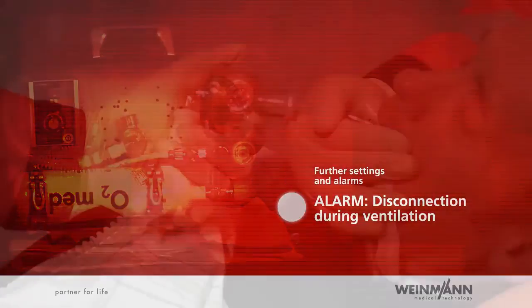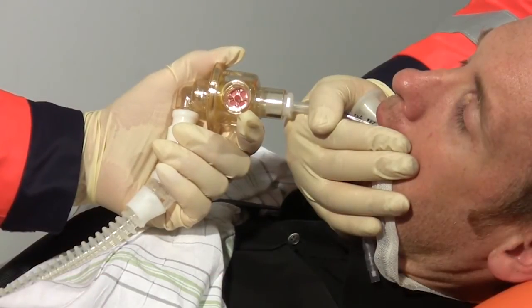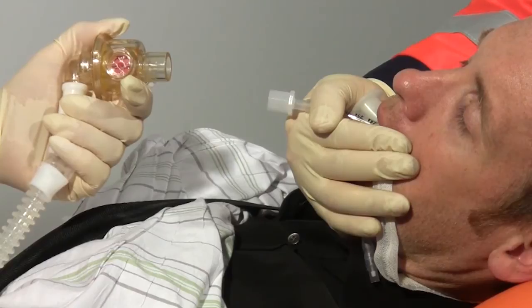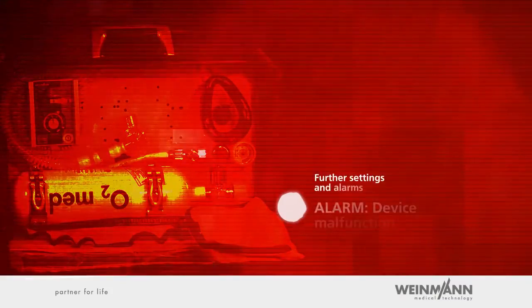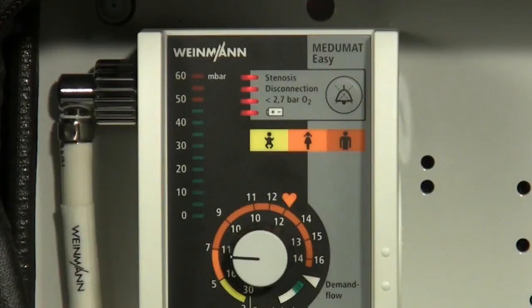Alarm — Disconnection during ventilation. Careless handling of the endotracheal tube can disconnect the patient valve from the tube. In this case, Mejumat Easy will emit the disconnection alarm after the machine's second unsuccessful attempt to apply a ventilation stroke. At the same time, the ventilation pressure gauge will show a pressure of 0 millibar. Alarm — Device malfunction: Mejumat Easy also emits an alarm at a device malfunction. If a malfunction is detected during the self-test made when the device is switched on or during regular operation, all the LEDs in the alarm field will flash constantly and an acoustic alarm will sound.